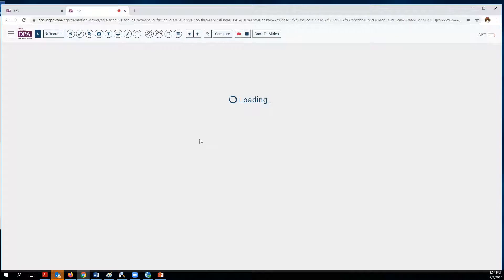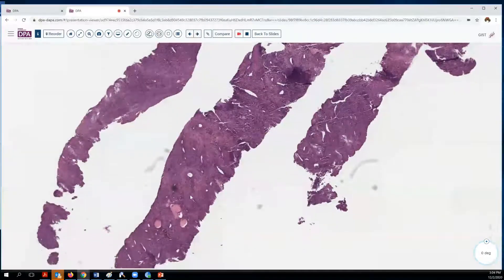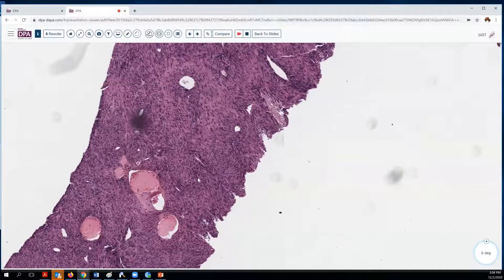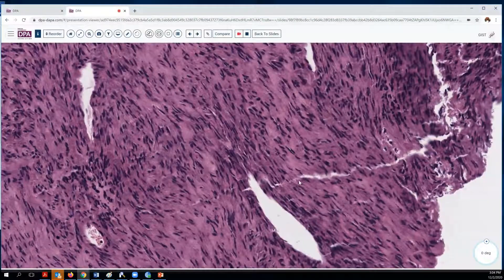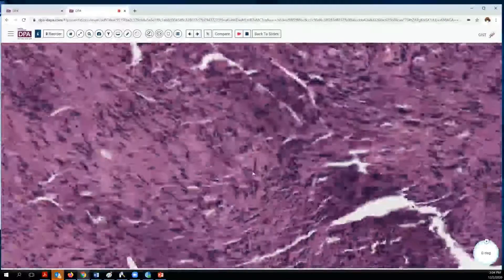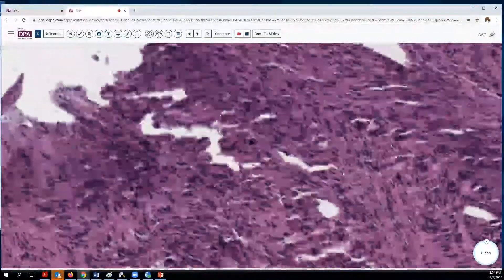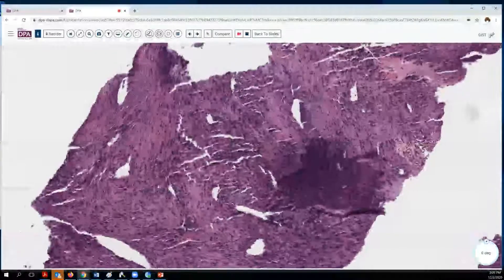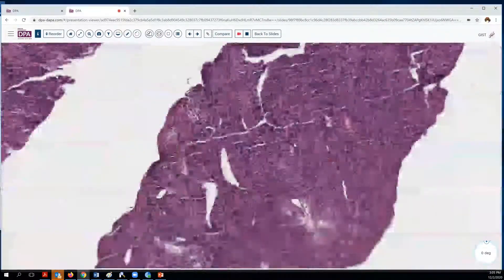Permanent sections on this lesion show us fairly good cellular features. We see some pink clearing around vascular structures, not a lot of mitotic activity, and again no necrosis, but a nice streaming pattern. So solitary fibrous tumor, GI stromal tumor, smooth muscle neoplasms, and nerve-derived neoplasms might be considered. Probably we wouldn't be thinking about dedifferentiated liposarcoma, but it's not beyond the possibilities as we evaluate things.